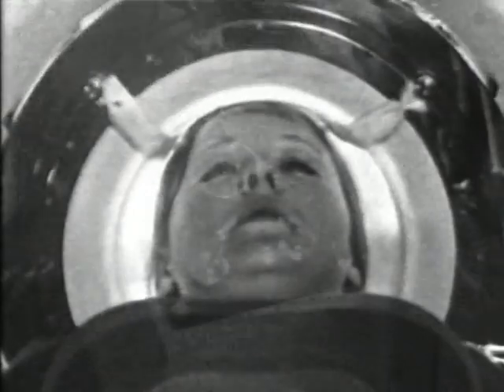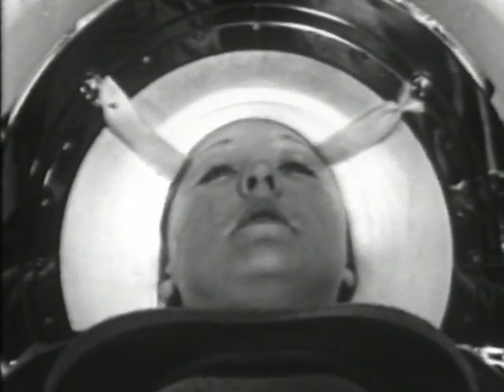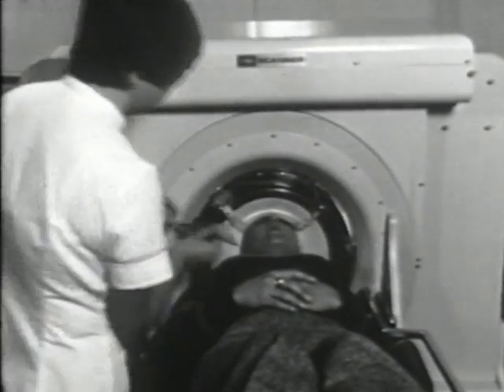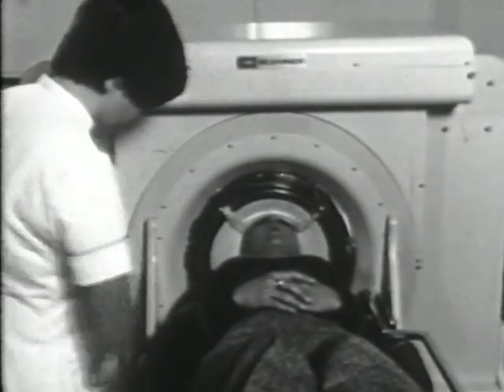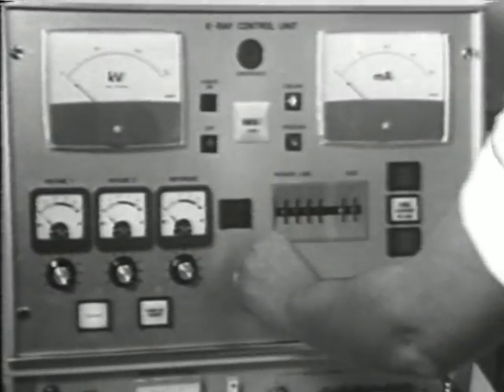When the patient's head is located in the box, the cap can then be allowed to shrink onto the patient's scalp, thus eliminating any air gap. A simple measuring device is then used to locate the correct level of the scan, and once the computer, X-ray control console, and scanning gantry have been correctly integrated, the scanning sequence can begin.